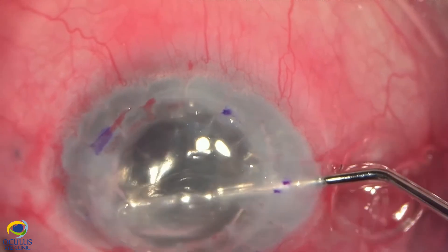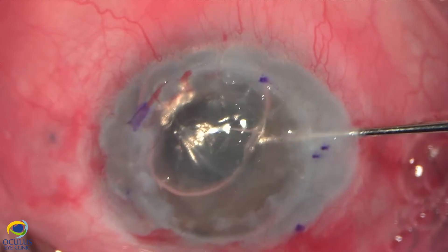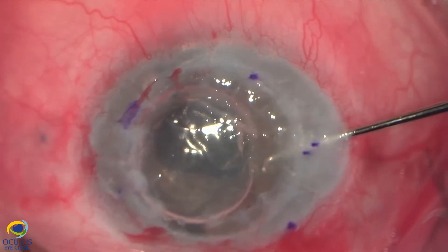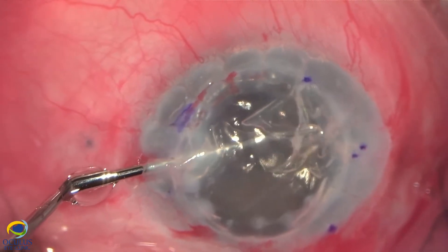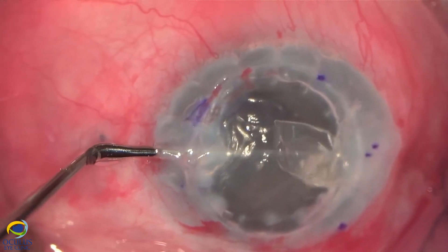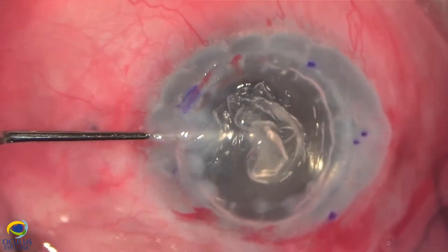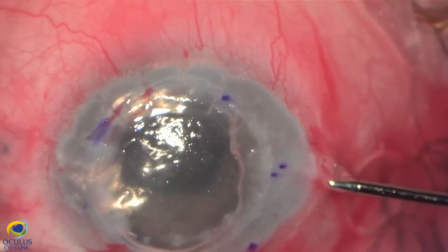Sometimes performing the descemetorhexis under air can be challenging because the air has a tendency to escape from the anterior chamber and the surgeon needs to re-inject air. Fortunately, that was not the case here because the anterior chamber is deep and the eye is quite soft, and we managed to perform the descemetorhexis quite easily in a single piece and withdrew it from the anterior chamber as a single piece.